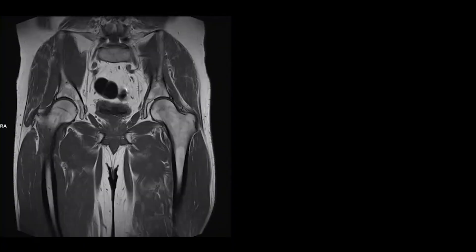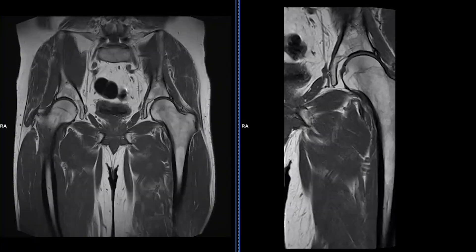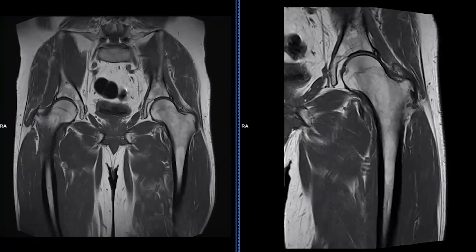Hey, what's up! Welcome back. Today I'm going to show you how you can achieve images from this to this — for long bone imaging, going from a large field of view to a smaller field of view. Let's go.